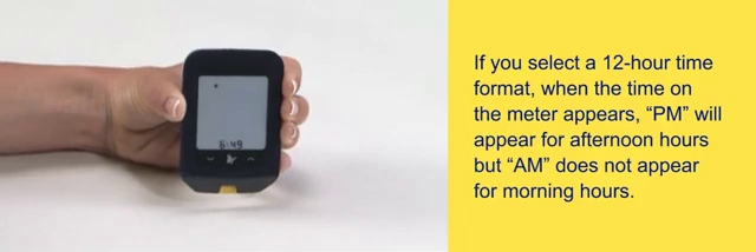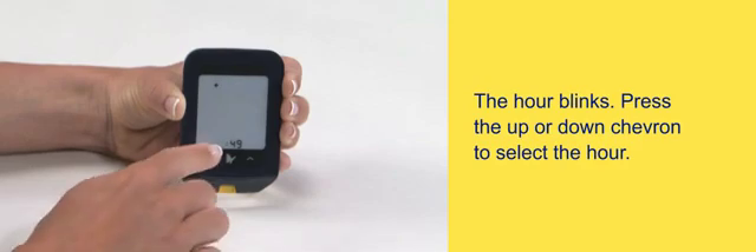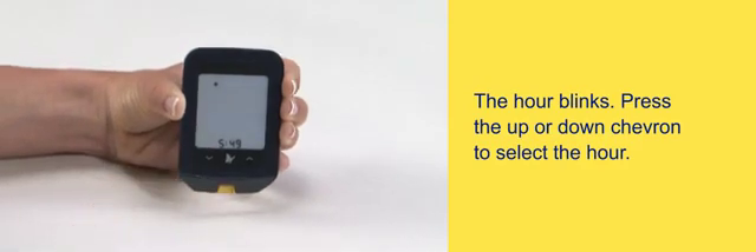If you select the 12-hour time format, when the time on the meter appears, PM will appear for afternoon hours, but AM does not appear for morning hours. The hour blinks — press the up or down chevron to select the hour.